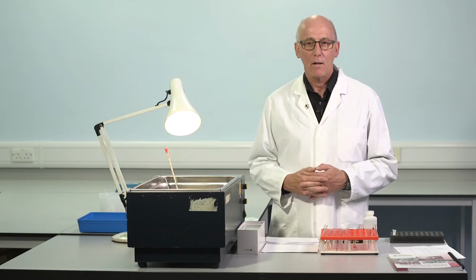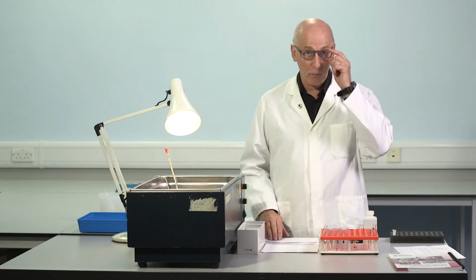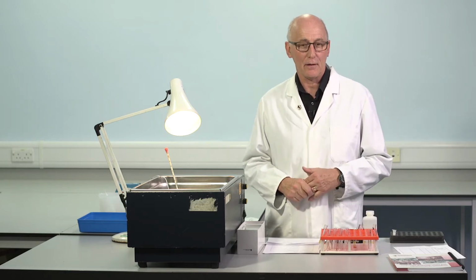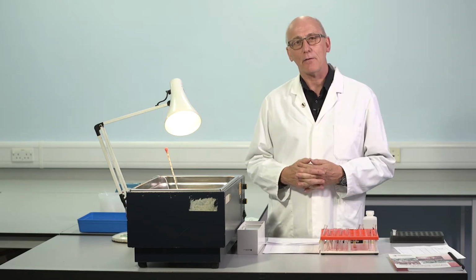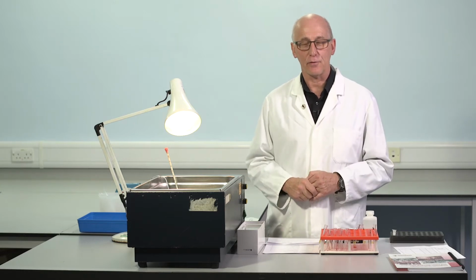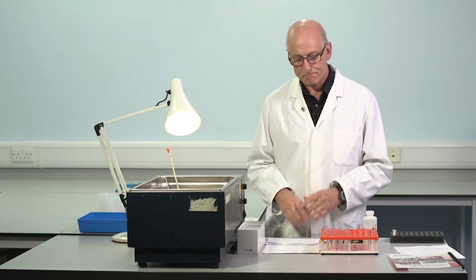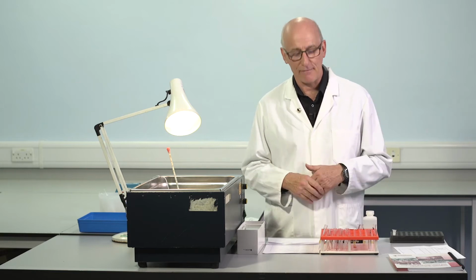So I think we should just remind ourselves first of the principle of the one-stage assay. It's based on APTT and uses the same APTT reagents as are used for APTT determinations. So the starting point, if we think about a patient with factor VIII deficiency, I think you know that this causes a prolongation of APTT. The more severe the deficiency, the longer is the prolongation. So there is a relationship. And it's really that relationship that we use to construct a quantitative assay.